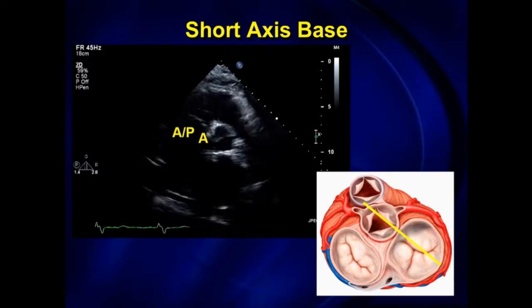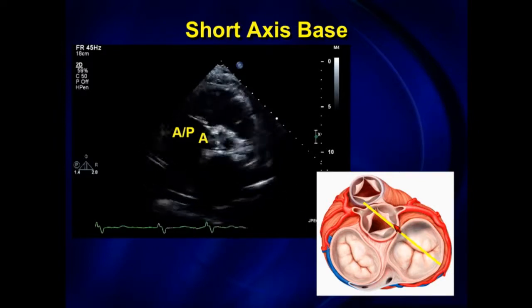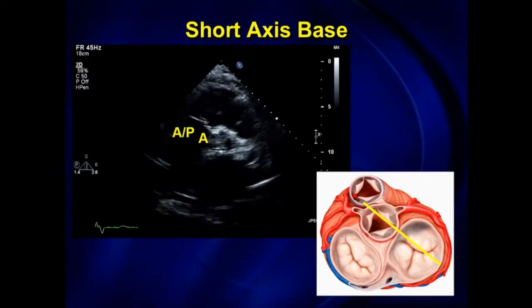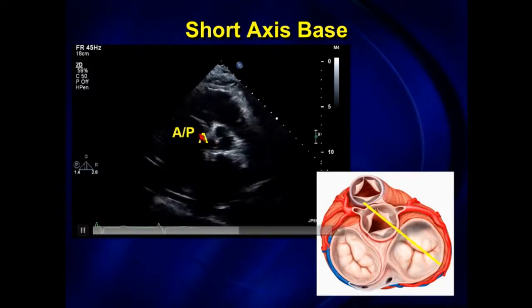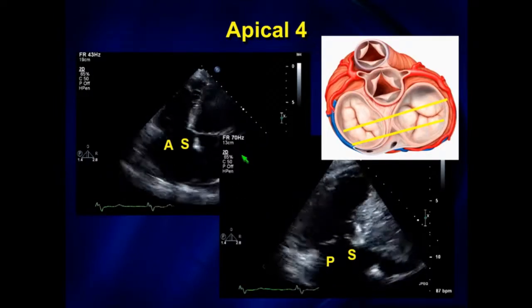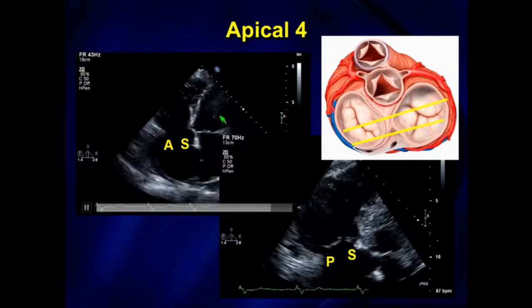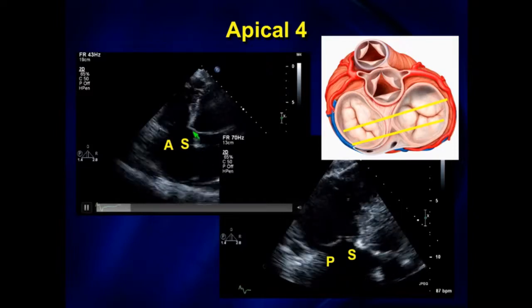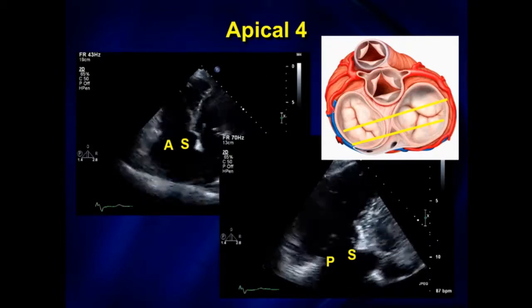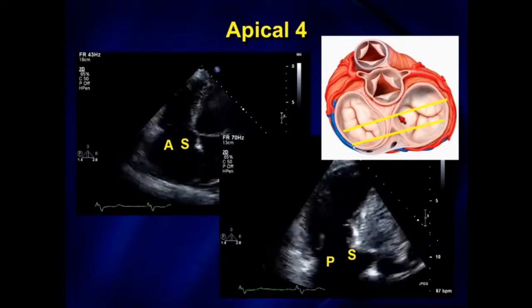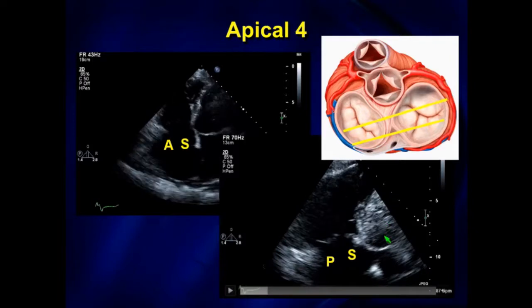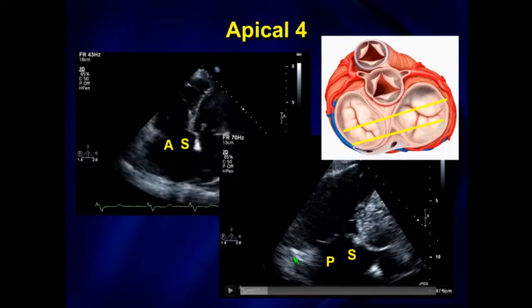The other standard view is the short axis at the base, cutting the heart in this plane. Near the aorta, we should see an anterior leaflet, but further down it's some combination of anterior and/or posterior leaflet — sometimes it's hard to tell where the transition is. In the apical four-chamber view, if you see the LV opened up, we're generally seeing the septal and anterior leaflets. If you tilt back a little and see a little bit of coronary sinus, not much LV or mitral valve, then we're generally seeing the septal and posterior leaflets.